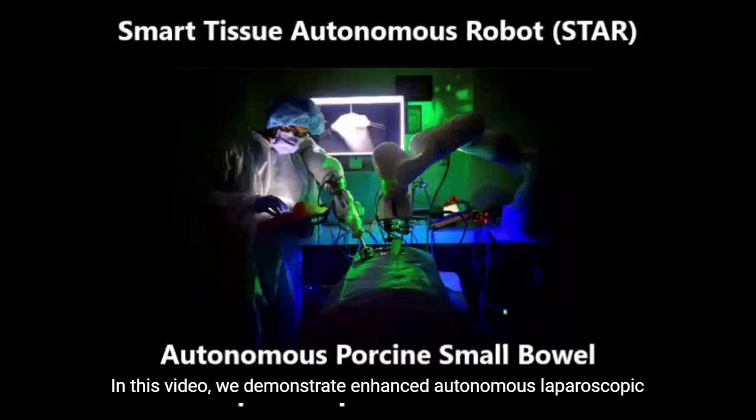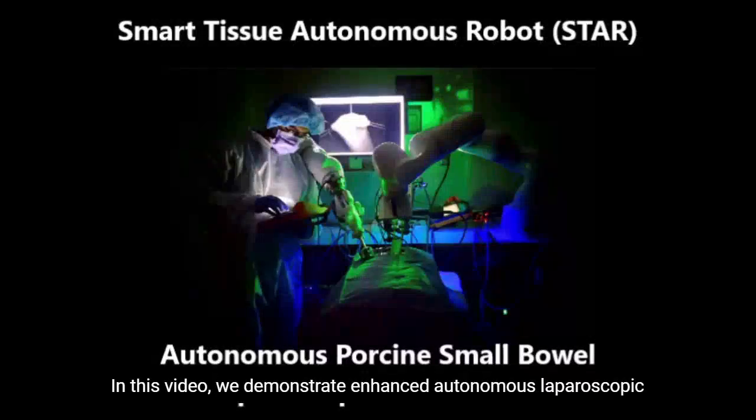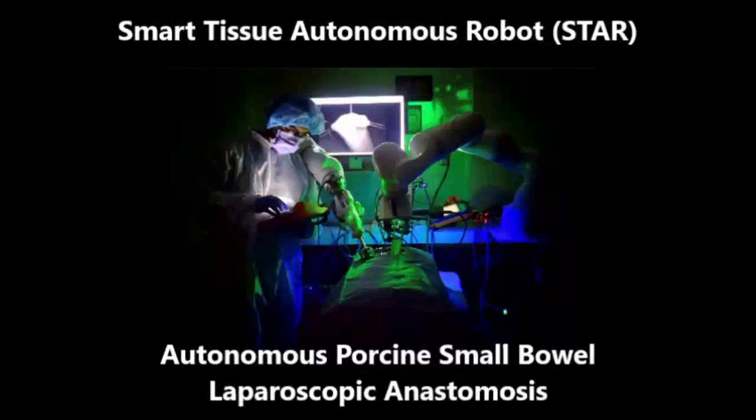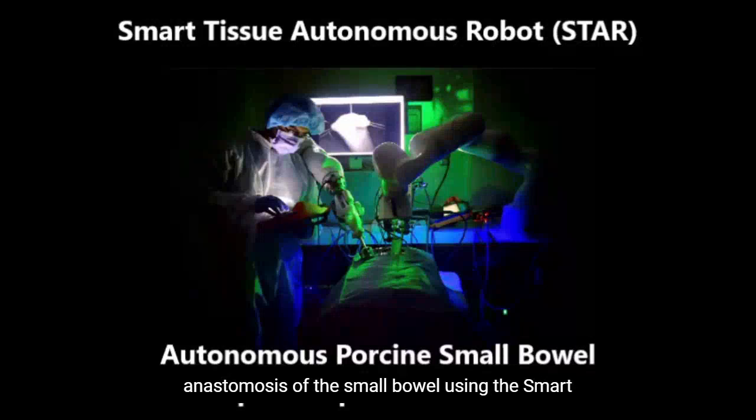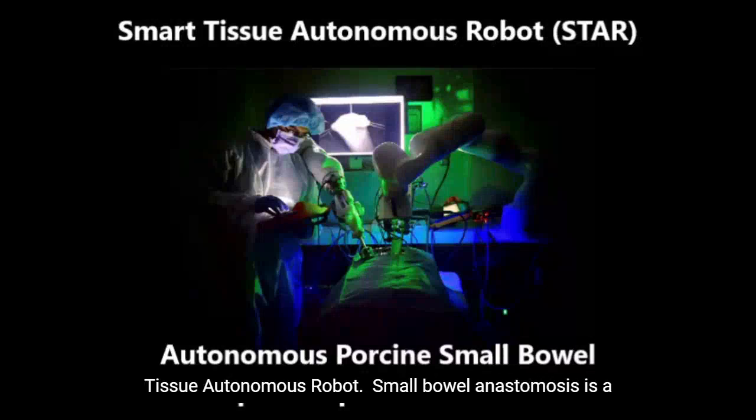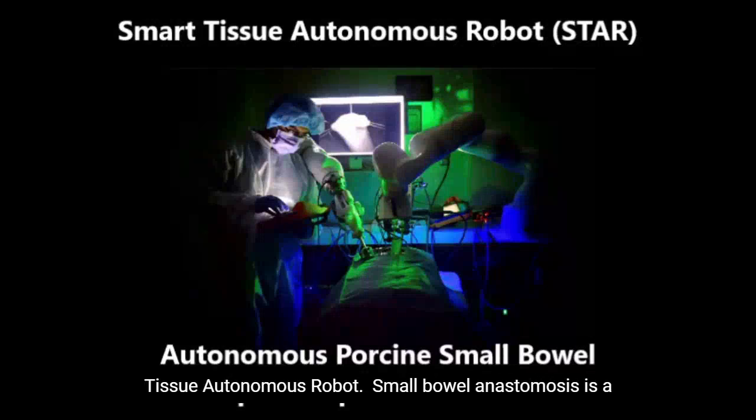In this video, we demonstrate Enhanced Autonomous Laparoscopic Anastomosis of the Small Bowel using the Smart Tissue Autonomous Robot.